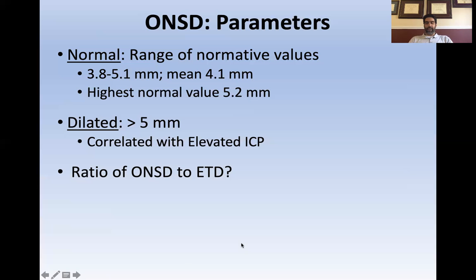This set of data and its validation is still in its infancy, so I wouldn't use this yet or quote this yet, but this may be something that is emerging when it comes to maybe trying to get a little bit more precise on what actually correlates with optic nerve sheath dilation.